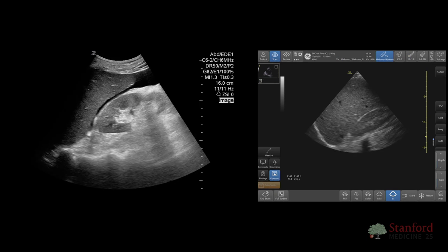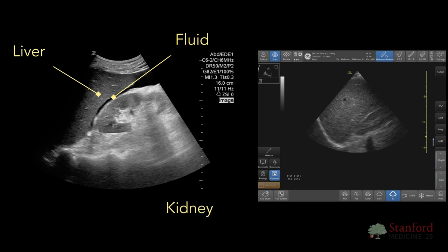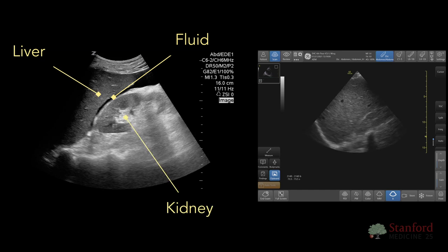In this video, we see fluid, which shows up as black, between the liver and kidney. This might be one of the first areas that ascites can accumulate in patients.